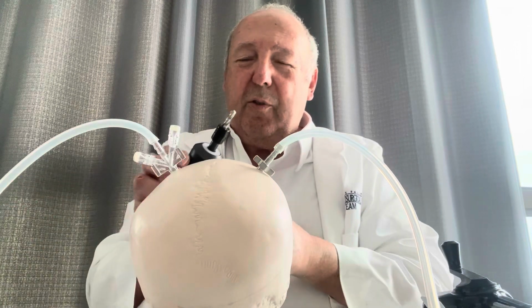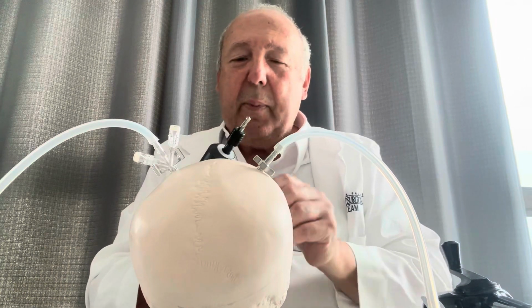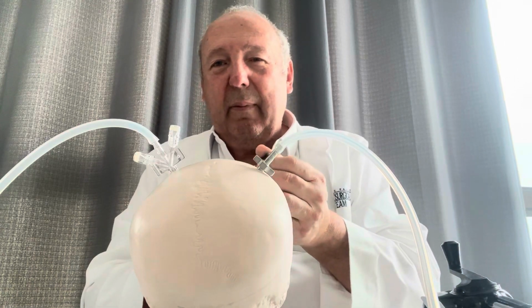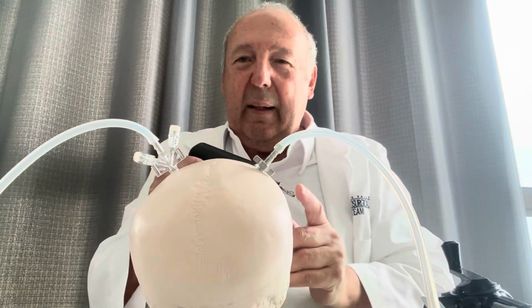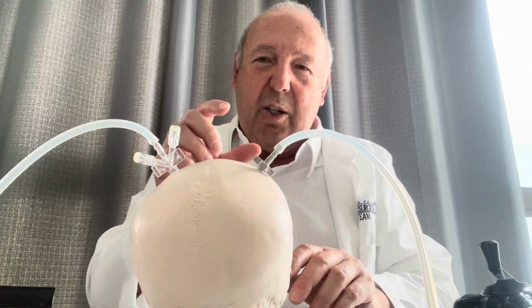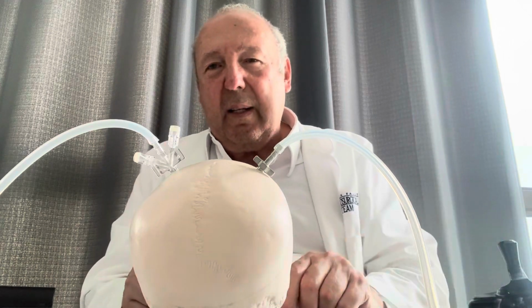The other feature of the drill bit is that the drill bit of the NASP has 3 cutting flutes, and only at the tip of the drill bit. So if you make a little small incision, the tip just cuts the bone and not the skin. While with the SEPS drill, you have to make a larger incision, put a skin retractor, and then make your twist drill hole without traumatizing the skin.